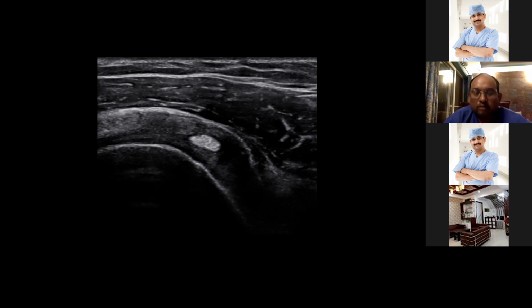So basically, in the ultrasound, we have seen all the tendons. We have seen the acromioclavicular joint. We have seen whether there is any glenohumeral joint effusion predominantly in the posterior aspect. We can see bursitis as well as the rotator interval. And we can talk of rotator cuff pathologies as well as biceps pathology. We can talk of adhesive capsulitis and bursitis and degeneration of the acromioclavicular joint.